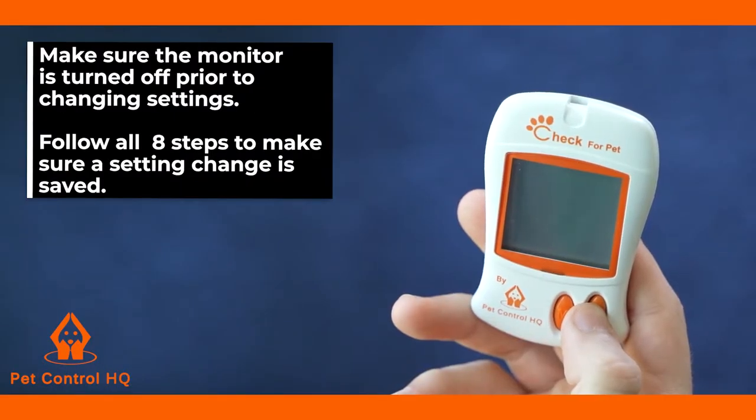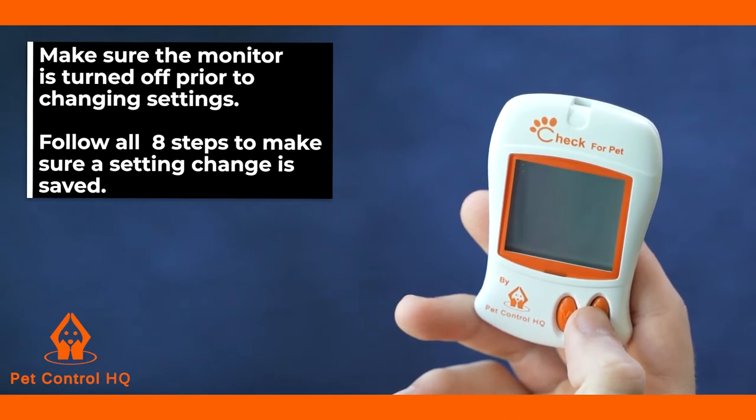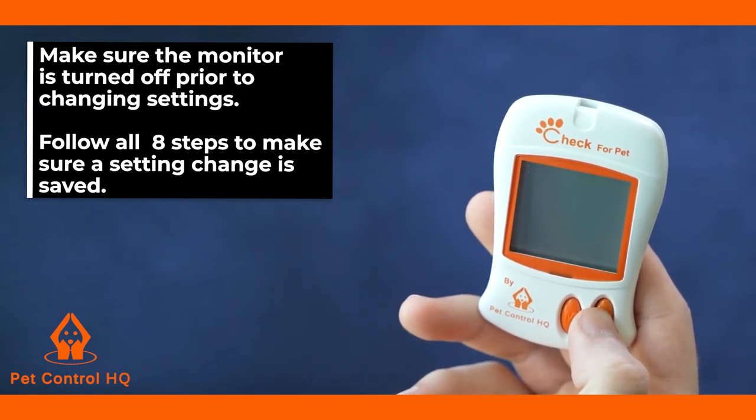It is important to make certain your monitor is turned off when entering the setting mode. You must follow all eight steps when making a setting change in order for the setting change to be saved.